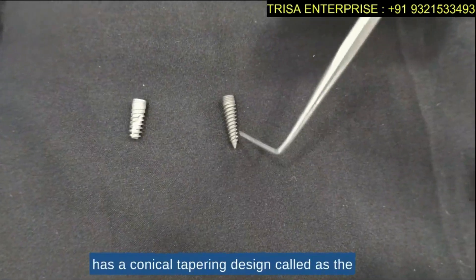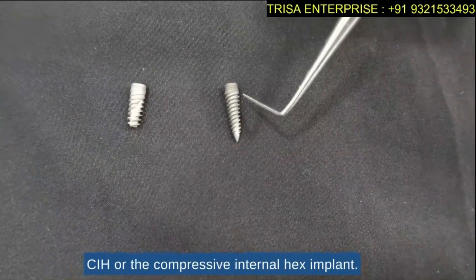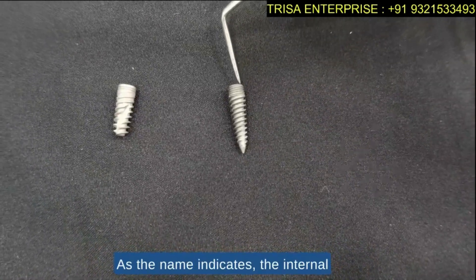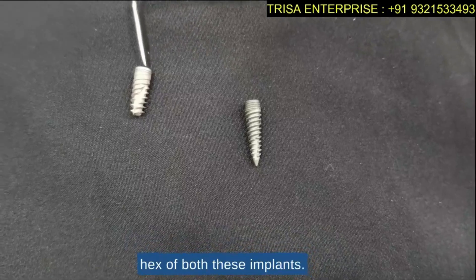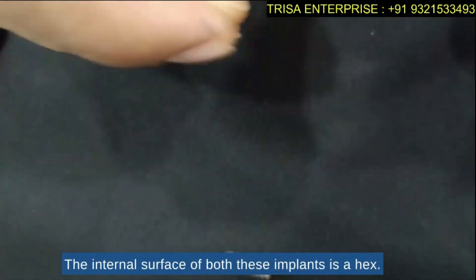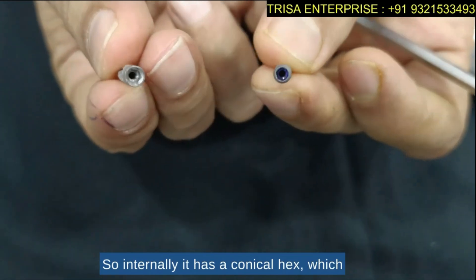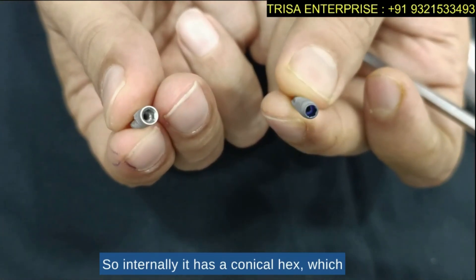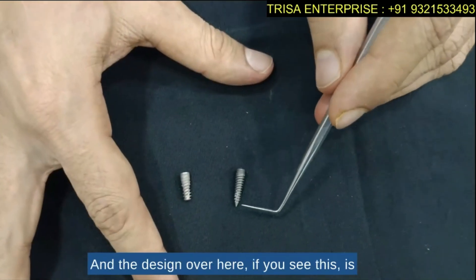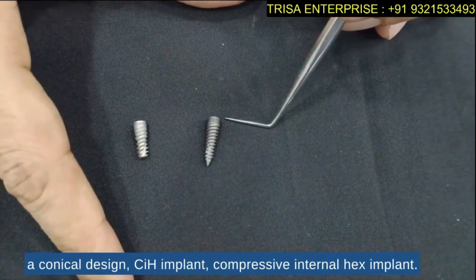The other implant has a conical tapering design, called the CIH or Compressive Internal Hex implant. As the name indicates, the internal hex of both these implants — the internal surface — is a hex. Internally it has a conical hex which will prevent any kind of screw loosening.